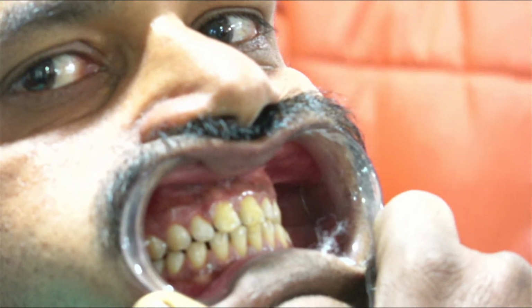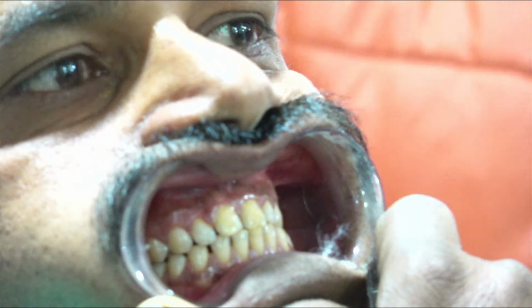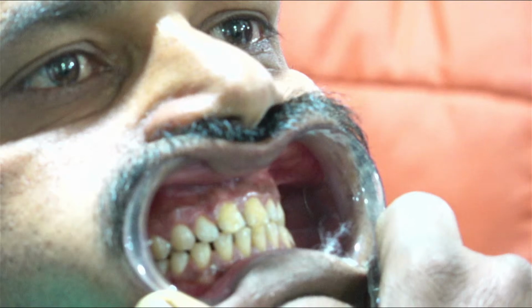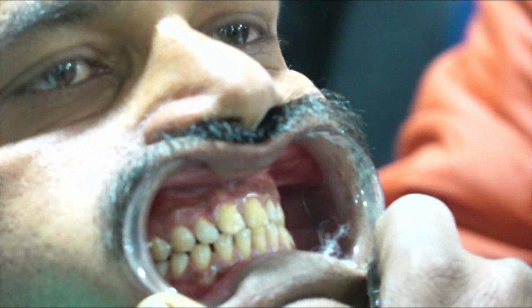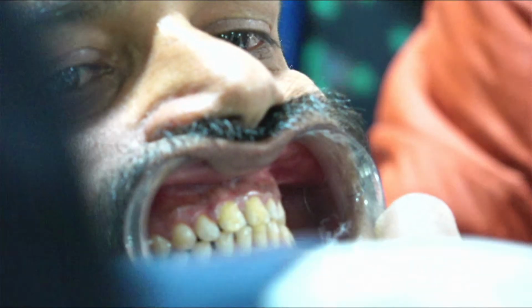These laser safety protocols you'll come to know. You can shut down. Exactly. Shut down. You can stop it and then do it, because I can't come here every time and get a lecture. I will take a little cotton now. I'll just have to wipe this like this. Now put the light on. For facial procedures it can be done, but with different settings. Those are entirely different lasers you have to use.